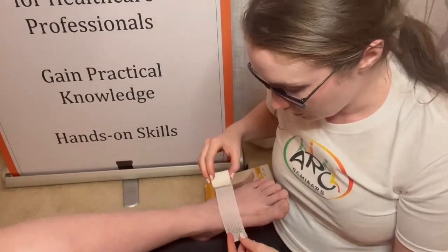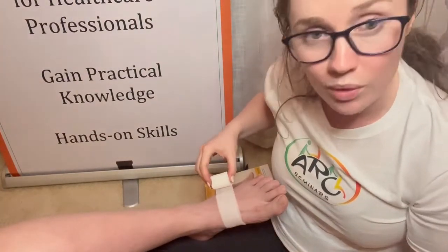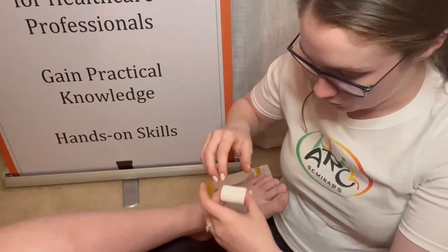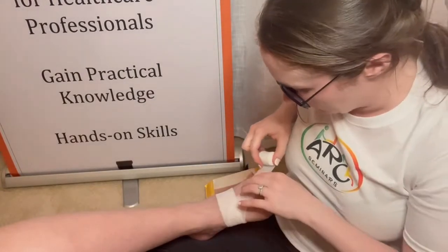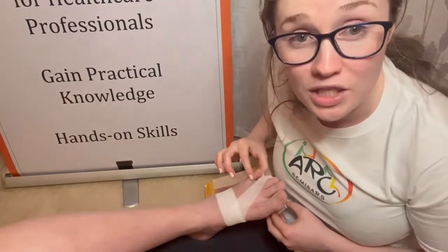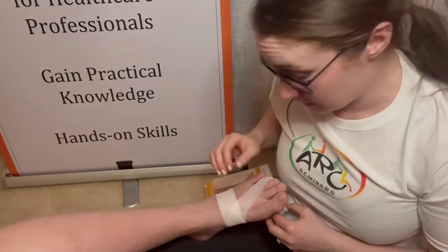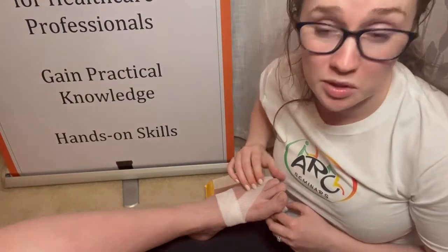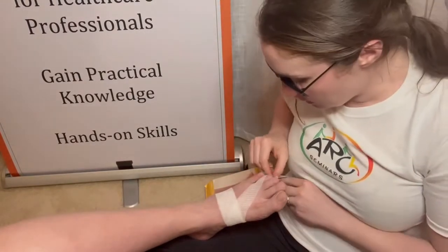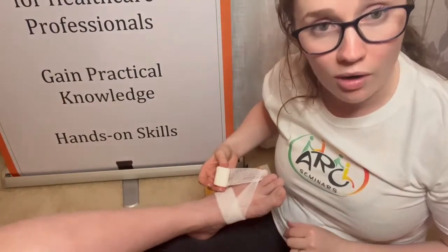What we're going to begin to do is layering the gauze over top of the foot. We're creating an anchor here, so we go over twice. Once we get to the top, we can start bringing it over at a diagonal angle. Now, I like to do the first 4 toes and to leave the pinky toe out because generally it's quite small. Bandages don't tend to stay on it well, and it doesn't retain as much swelling as, say, the great toe, 2nd, 3rd, and 4th toe. So we're going to bring that diagonally over, lift and separate the toe, and bring it across.